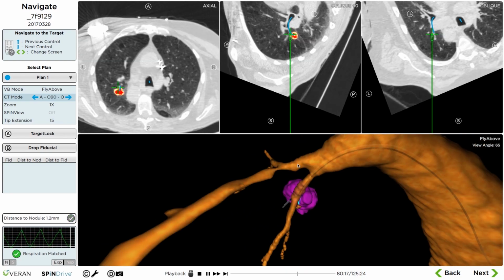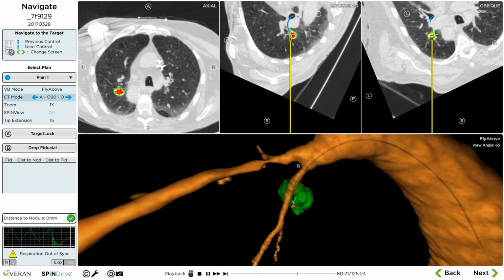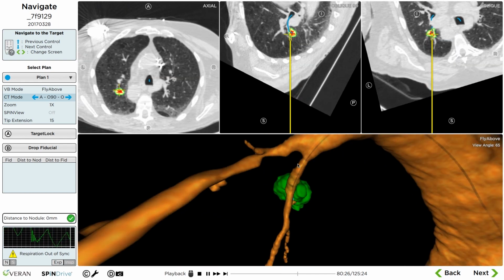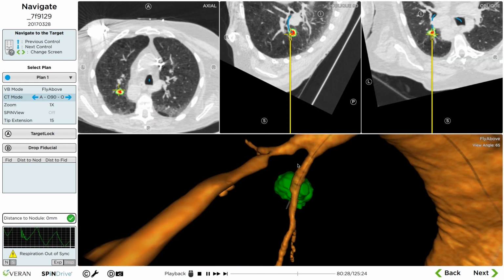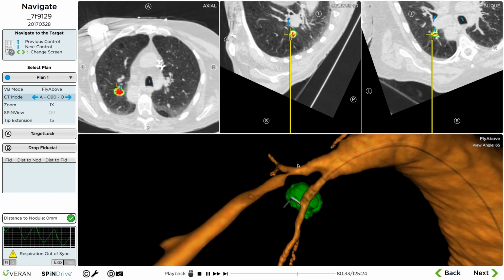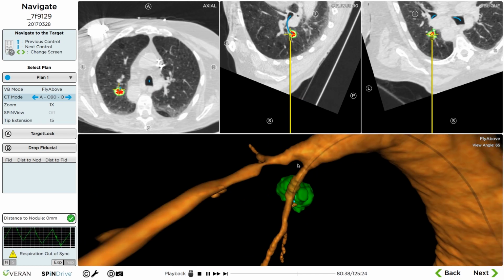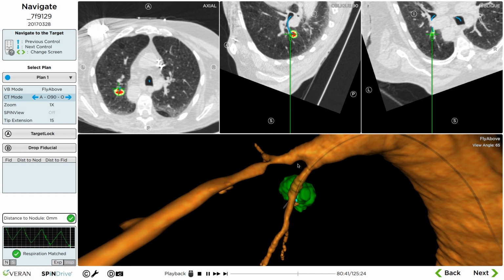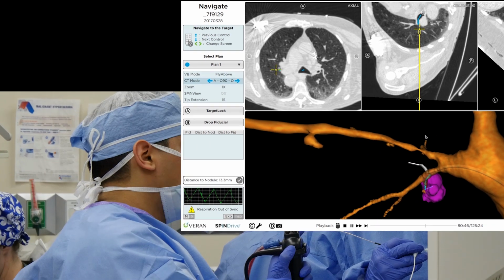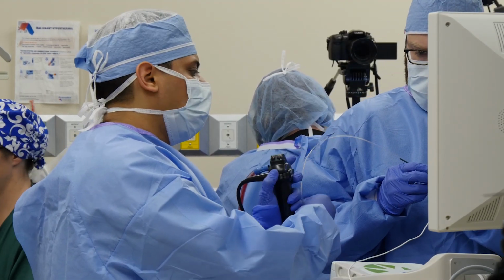That whole section. That small needle, Dr. Bach, I would do just a couple more passes before we jam it up essentially. Okay. Needle section off. Needle back. Needle back. All right.